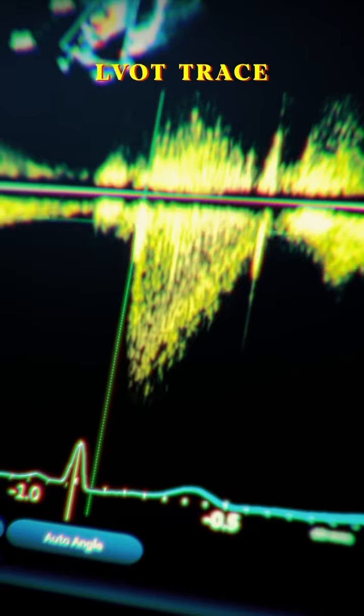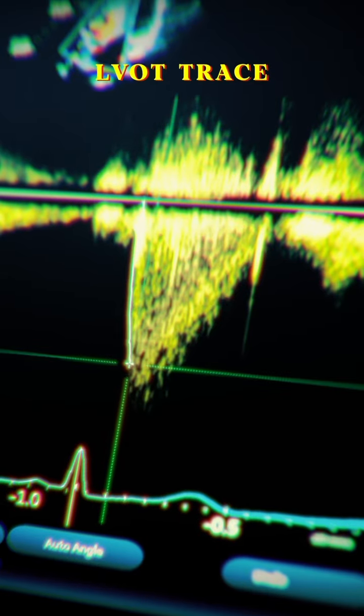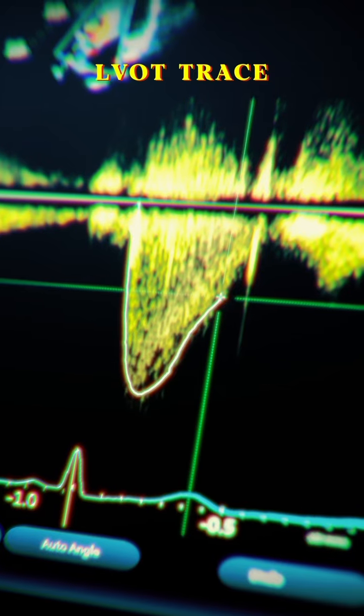When we pulse wave the 5-chamber, we want to make sure that the sample volume is just above the valve, and we can see clearly we're in the right spot from the closing click in our trace signal. Making sure I wipe the probe, so Ari's happy.